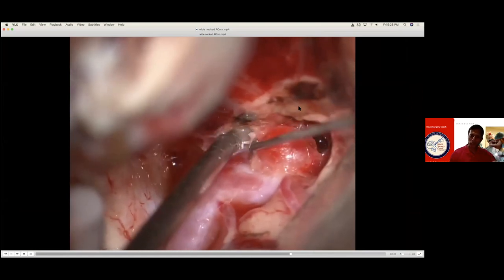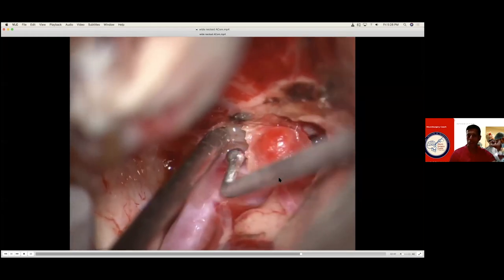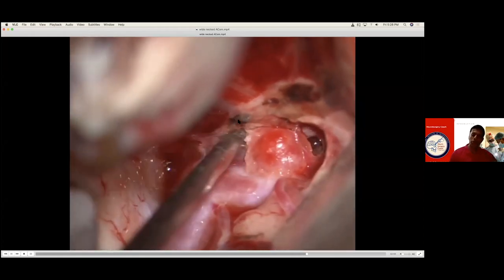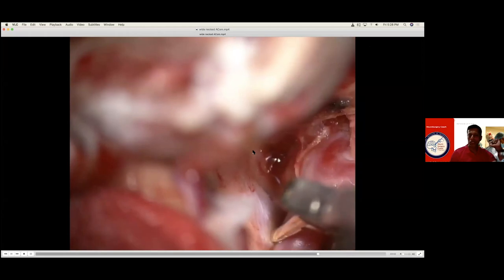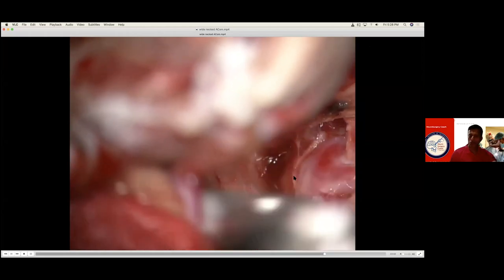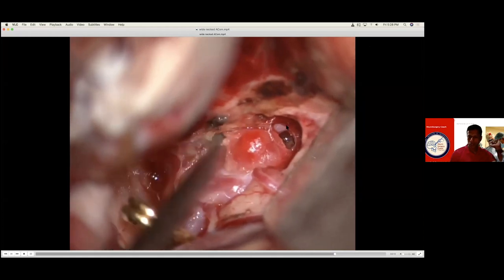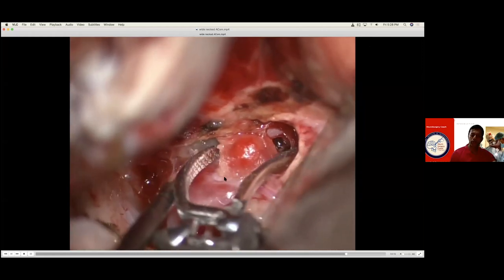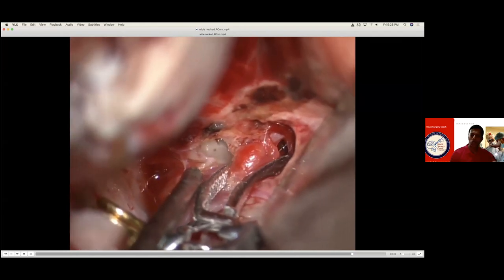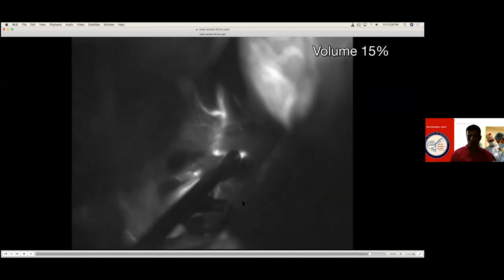Now you need a clip to make sure that this A2 is not entrapped. In this kind of case, it's very common that you inadvertently take the other A2. You can see the other A1 now — there is the ACOM complex. You are worried about that A2. So you are going to put a clip parallel to that A2 without taking that A2. That A2 can be seen clearly and that aneurysm is clipped.